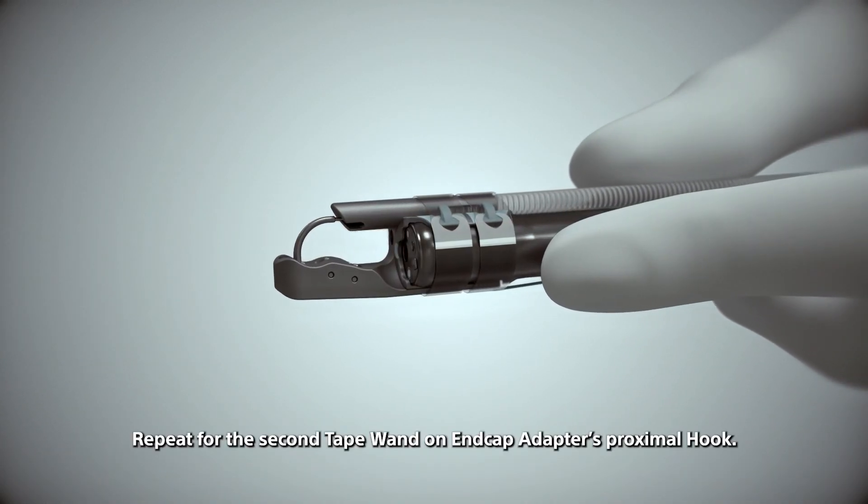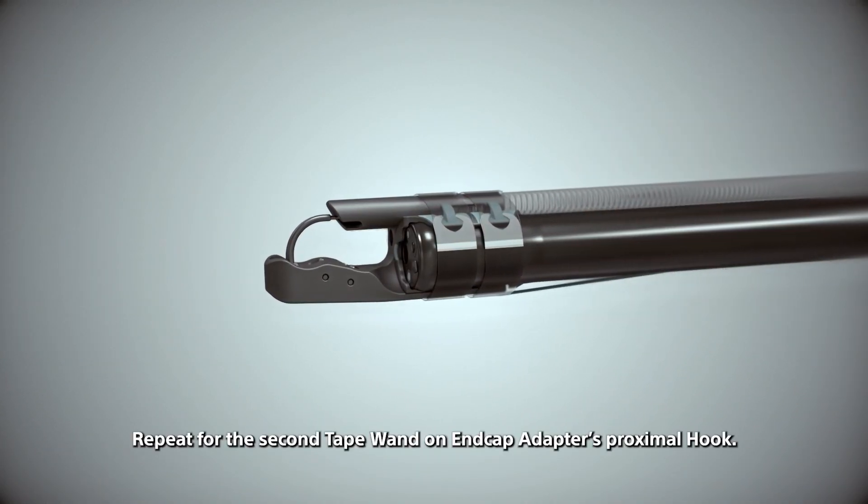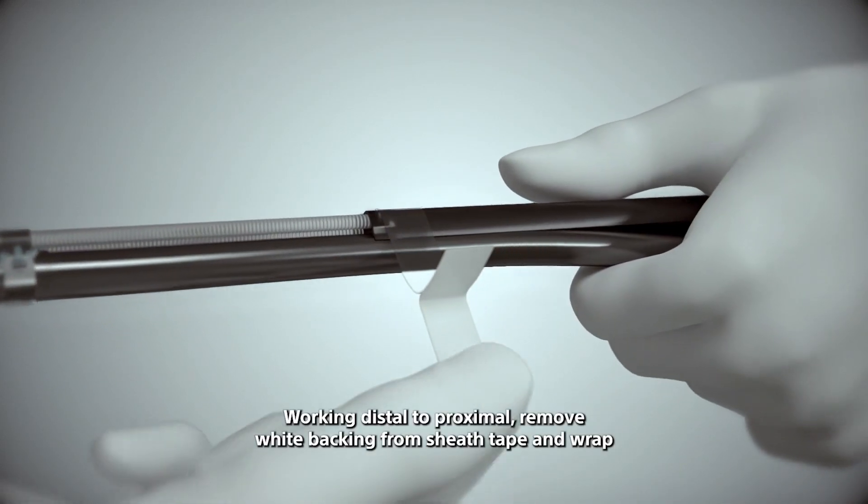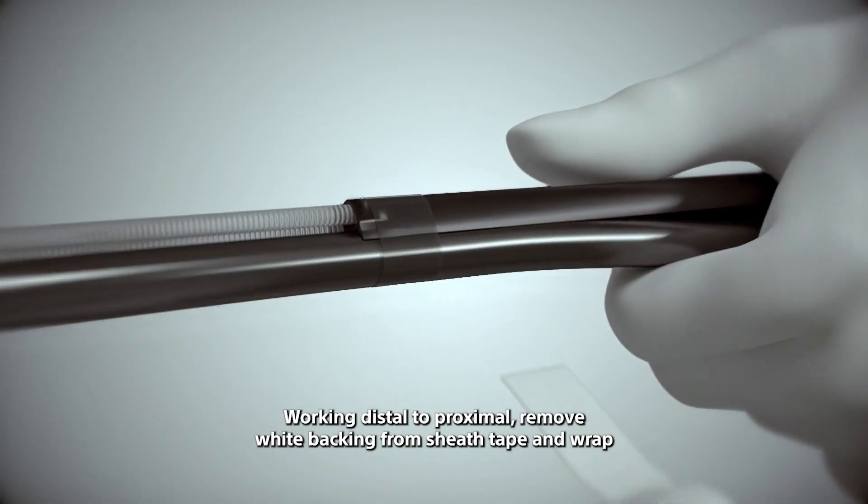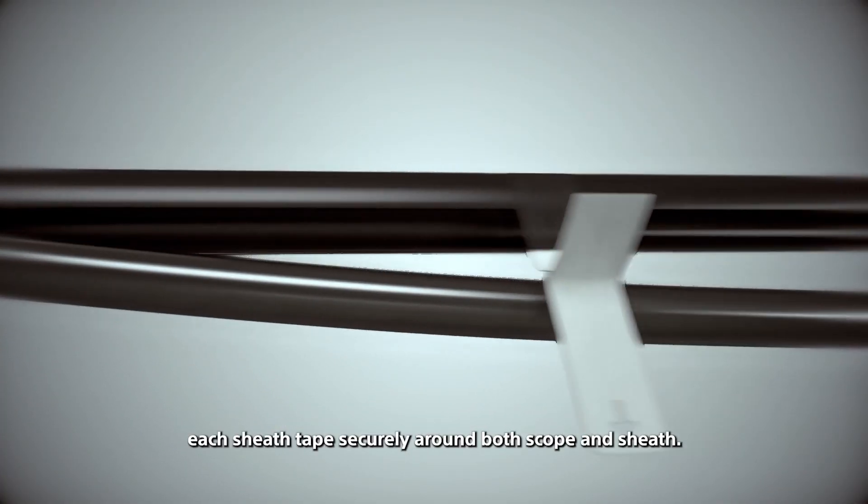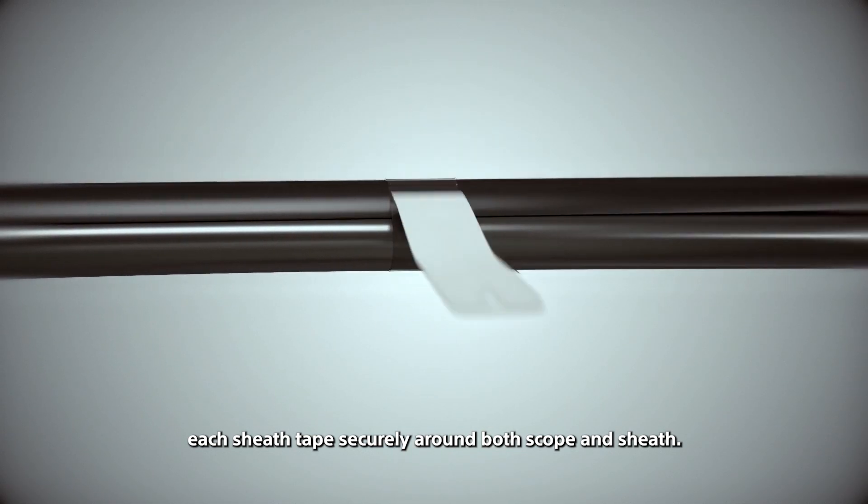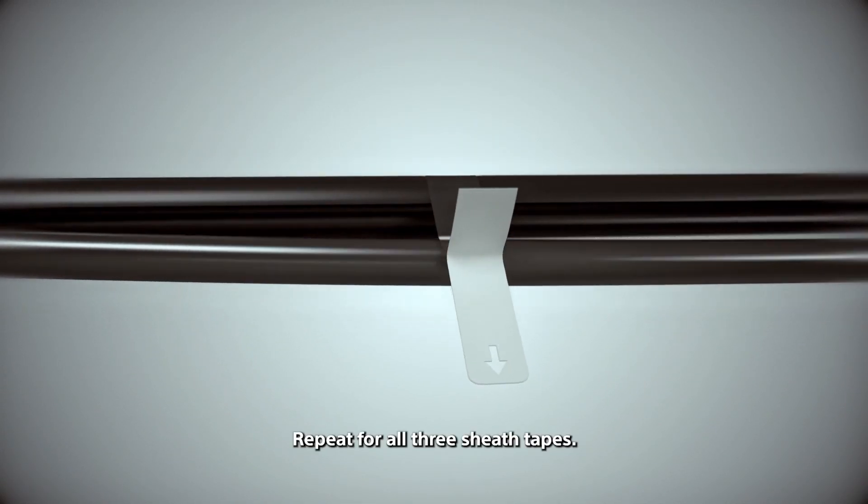Repeat for the second tape wand on end cap adapters proximal hook. Working distal to proximal, remove white backing from sheath tape and wrap each sheath tape securely around both scope and sheath. Repeat for all three sheath tapes.